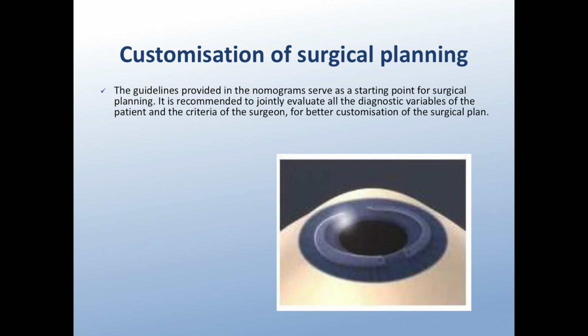We can recommend to customize our ring system as much as possible, to rely on competent people who can give us advice because they have implanted so many. The same company provides a website and an application to rely on. I can still give you a couple of tips when it comes to implementation. For example, use a topographer that has a ring simulation program inside. This has a Scheimpflug camera, or OCT, that work the same way.